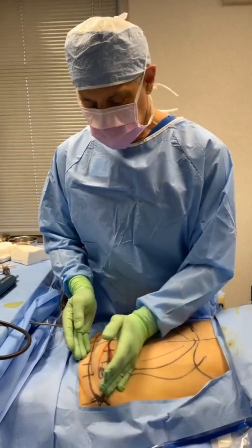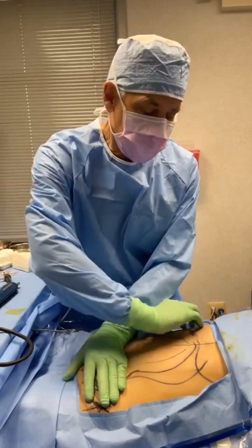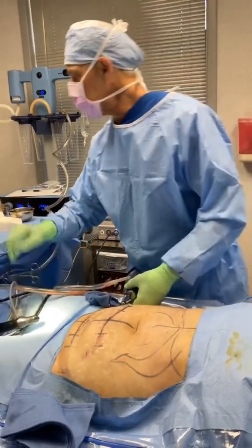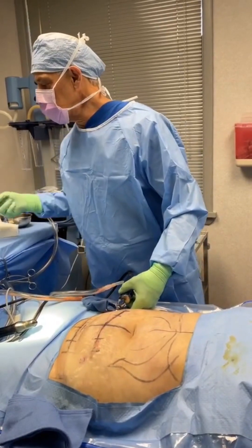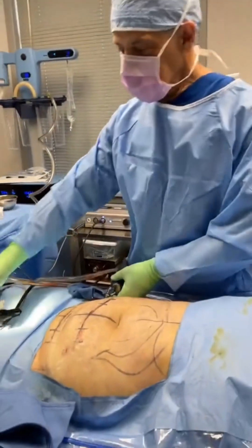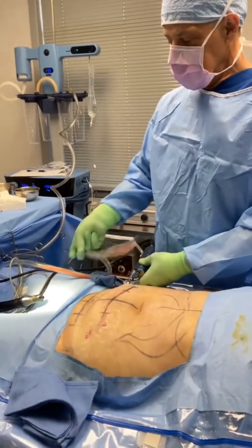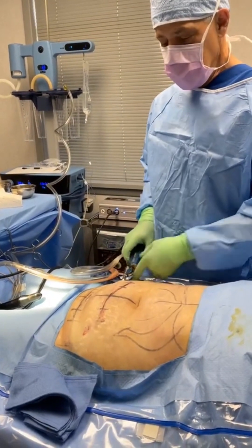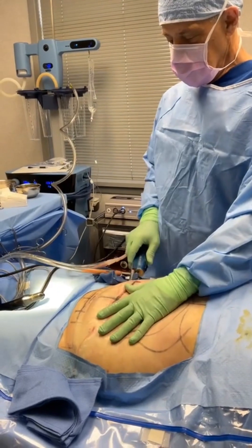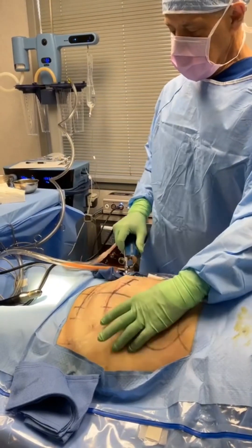A bunch of those stretch marks are going to be history as we cut them out, pull all this down, and give a tightening treatment up here. I use this VASER device with a little probe on it — this probe here — and I bounce the fat cells off. Now I'm going to suck them out. If you look here, you can see fat cells flying in the tube. If I don't move under the skin, they don't do much. If I move like so, you can see they continue to inch their way forward.